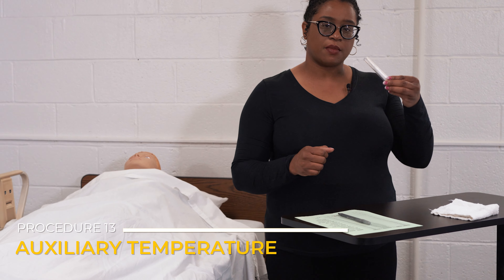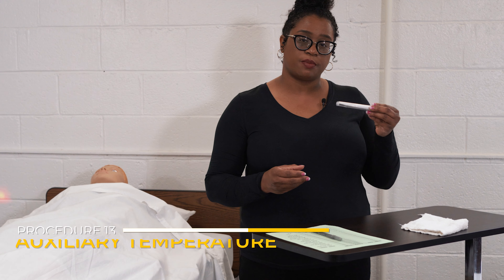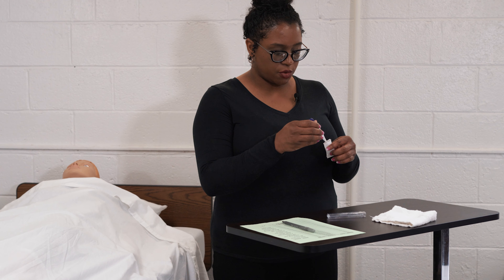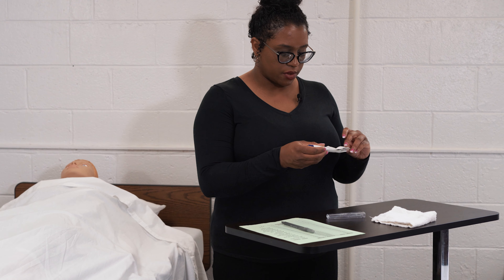We're going to perform the initial steps. We're going to take the thermometer from its storage place or battery source, and then go ahead and put the thermometer probe onto the thermometer.